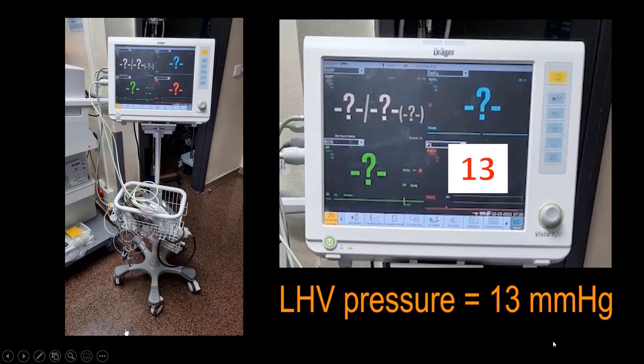You need to use the mean of these values. For example, if the different measurements were 12, 13, and 14, you need to use the mean of these — in this case, 13 mmHg.